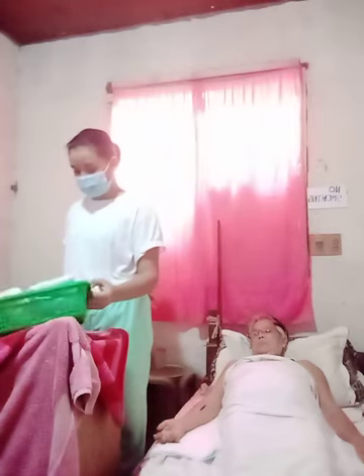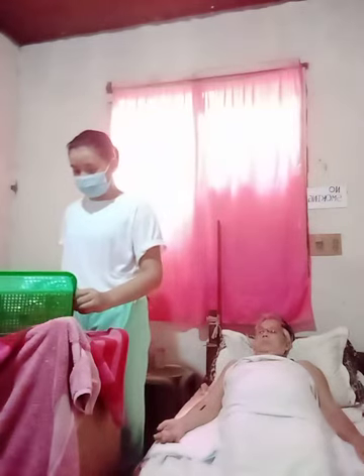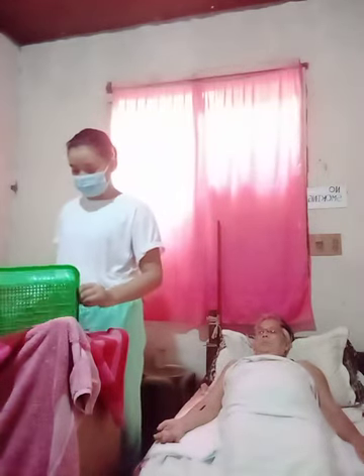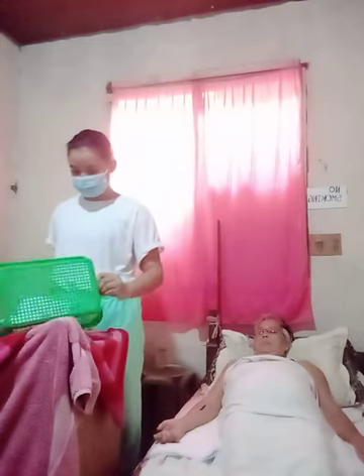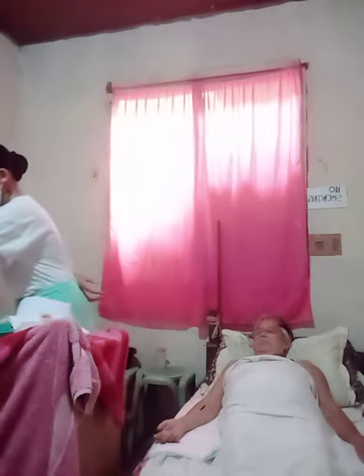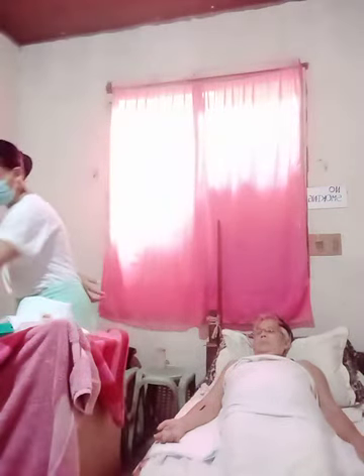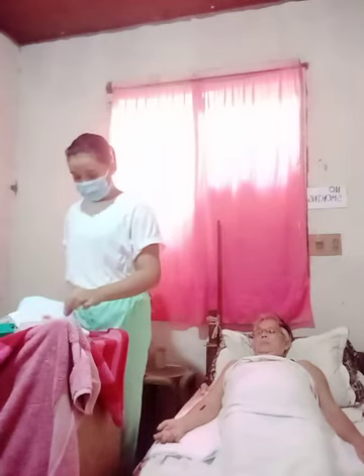Carefully get that item onto the sterile field. Then put it on the side. Then get the forceps.